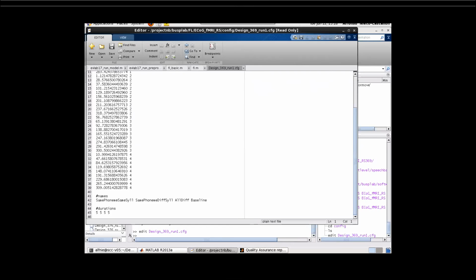Whether you want to correct for that or not is up to you, because typically half the time of a TR is not a huge difference in time. But if you want to correct for all of the onsets, and for the fact that you are not specifying 0 as the time at the beginning of the first acquisition, but 0 is actually the time of the middle of your first acquisition, then you can change the actual onset times to reflect that.